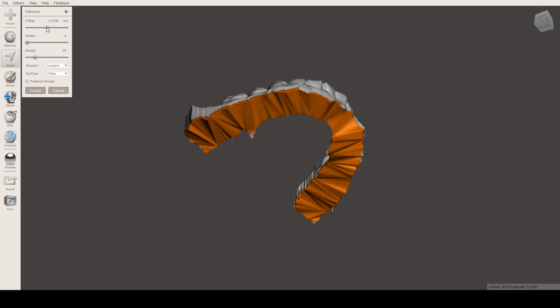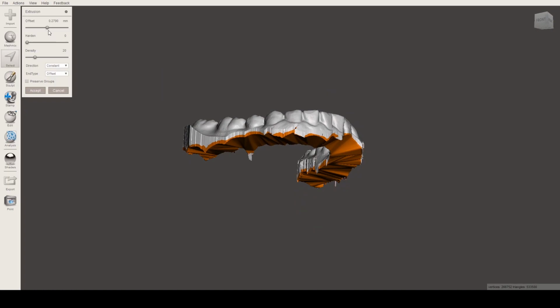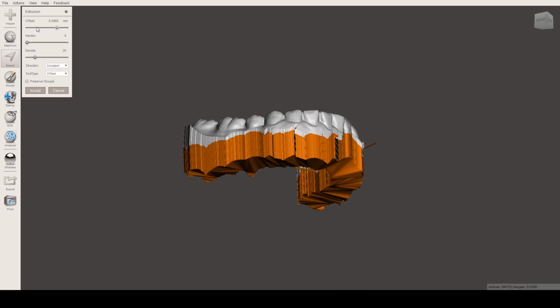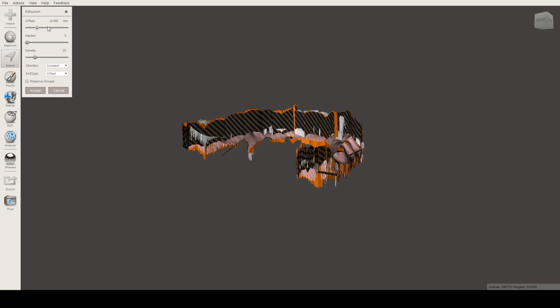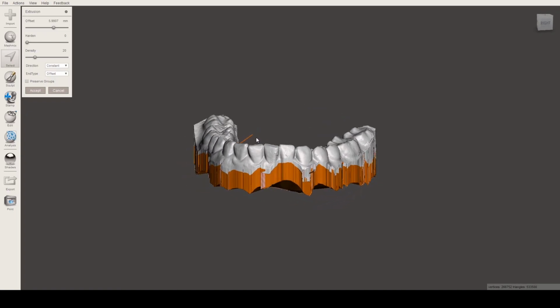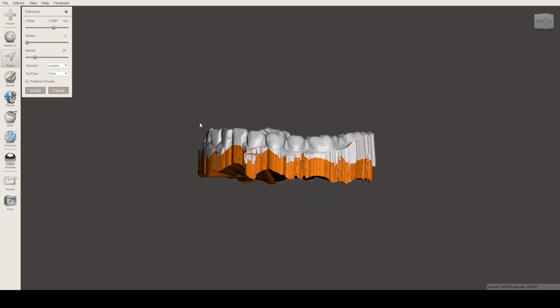So, okay, now we have our area that's selected. As you can see here, if we adjust the extrude or the offset bar, it's gonna be smaller or bigger. So we want to add more layers. So we wanna move this scroll button to the right. Same thing, if you want to make it smaller, then move it to the left. I'll just click the part here. Well, it's pretty slow, so it will be a negative extrusion, and it will show you that. But we want positive extrusion.